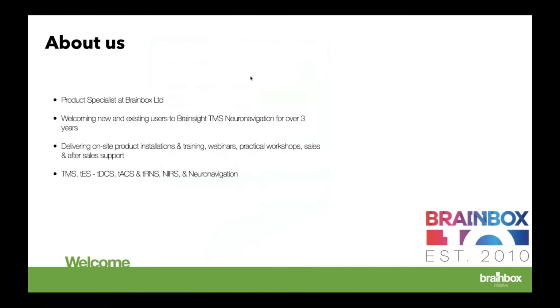So if they were to purchase it, I would visit them with the equipment, do the installation, do a bit of training with them as well, making sure that everything is running smoothly. More recently, obviously things have gone online, so those installations now are done like this, which has posed a new challenge, which is a lot of fun. And then obviously online we have our conference, which we helped out with, some workshops which we'll be bringing to you, and then the standard after sales support as well.